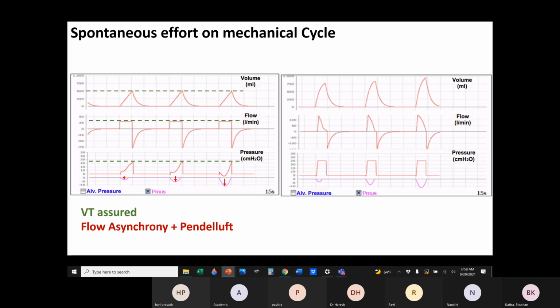Opposite to that, for the same kind of setting on the ventilator, if you increase the muscle pressure, as in negative pressure by the muscle force, then in a pressure control breathing, because you've set the pressure control, it will not change. It is what the ventilator will continue to do mechanically.